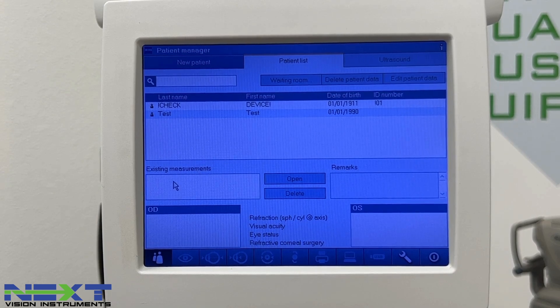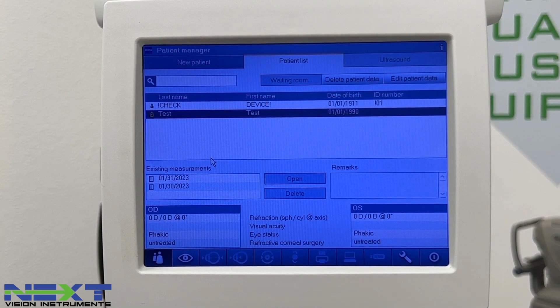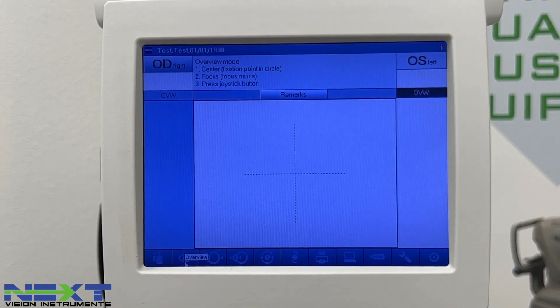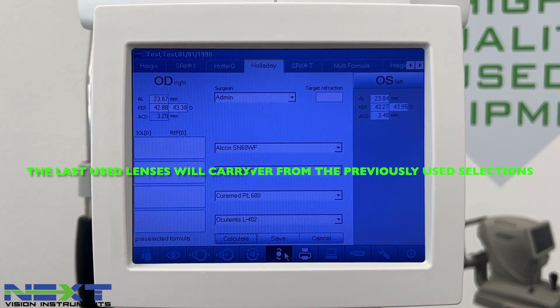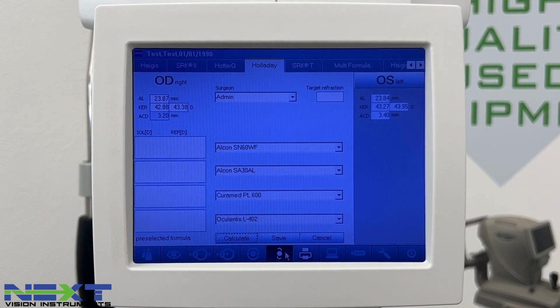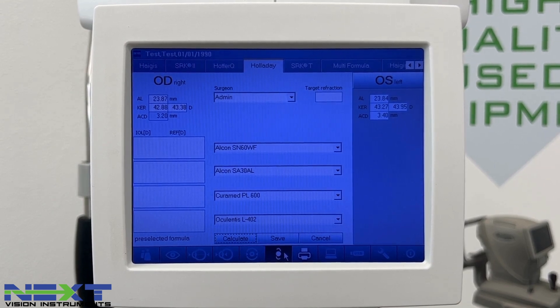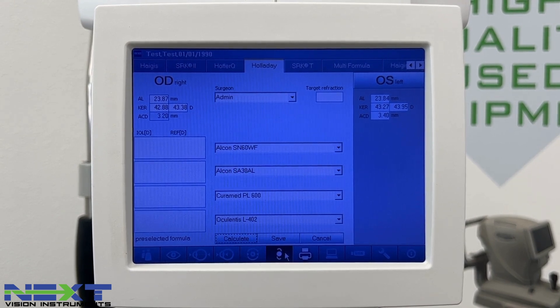If you want to rescan a patient completely without pulling up the previous measurements, highlight them, click the joystick button, and navigate to the eye. If you have questions on how to configure lenses, add surgeons, or set preferences, refer to the user's manual or call our main office number at 727-483-9140 and you can be connected with a technician who can assist over the phone.